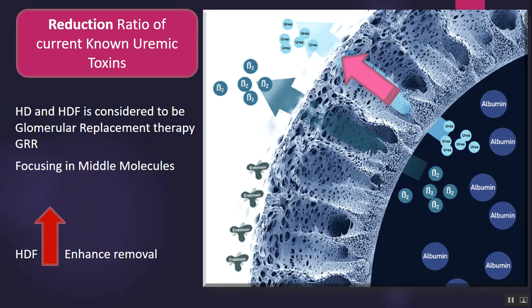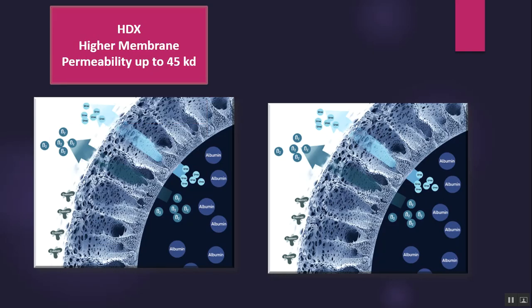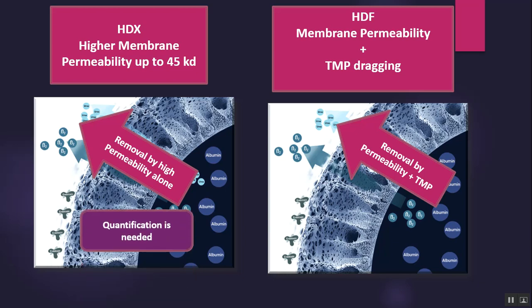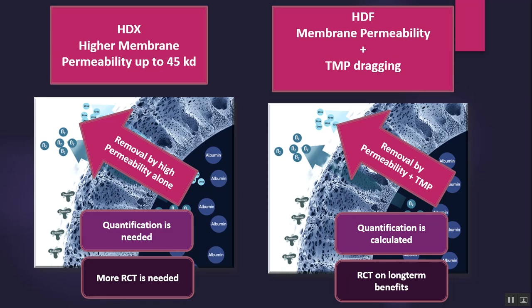HDF enhances the removal by dragging forces, meaning that through the transmembrane pressure it can remove bigger molecules, while HDX, with higher membrane permeability up to 45,000 Dalton, can remove such molecules with only the membrane permeability. It's still early to document that in research, but it's going. We need more randomized controlled trials to compare between both therapies.